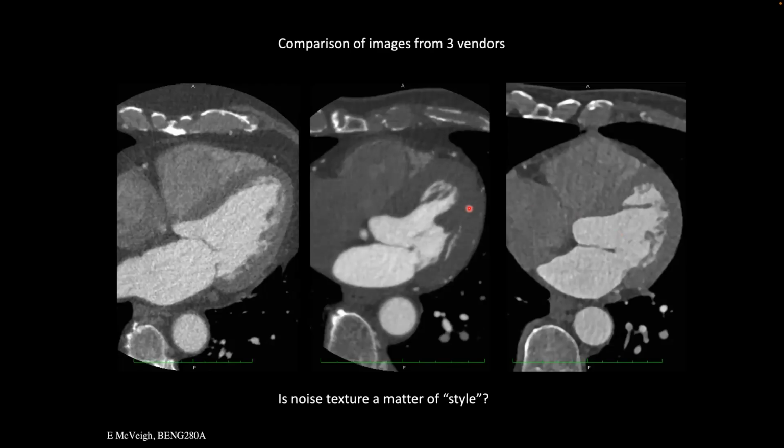But also, there is the resolution. Most people use 512 pixels, and when you say resolution, it's displayed with the same pixel resolution. There's no difference there. Obviously, the resolution is different, right? This point spread function is wider, say, than this one, right? That's how this got there.